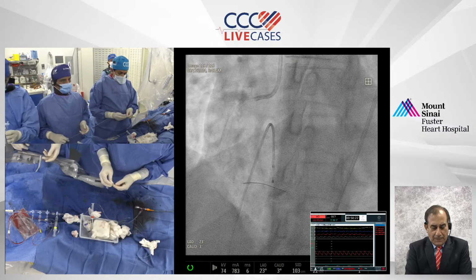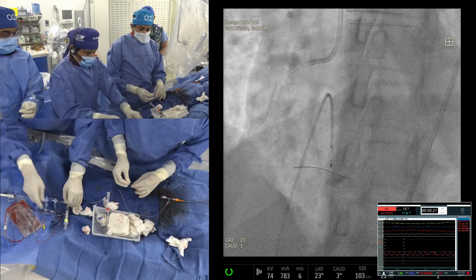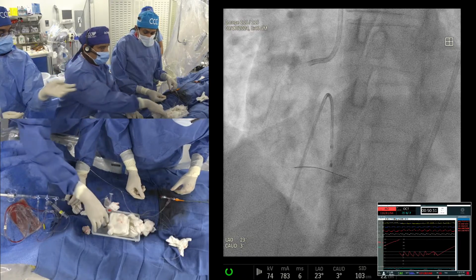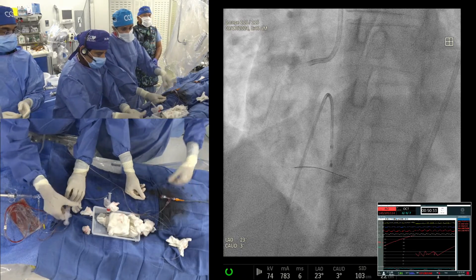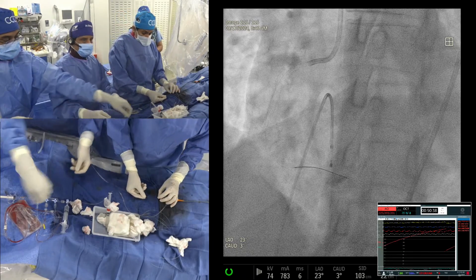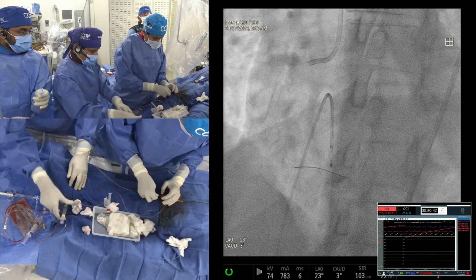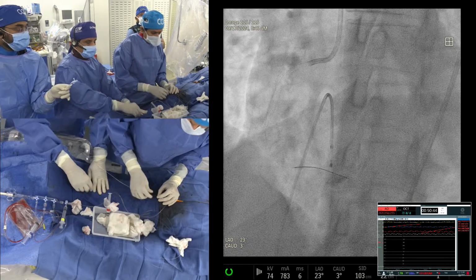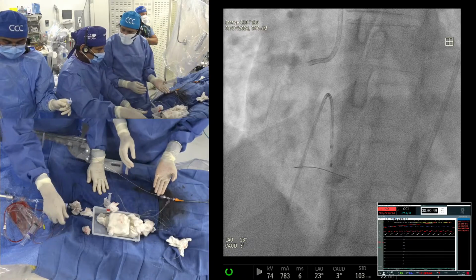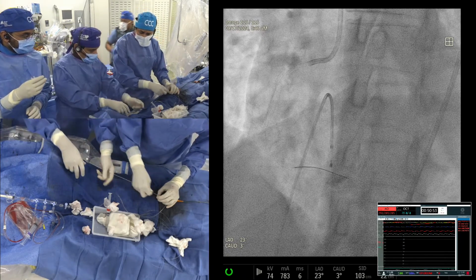The question also is why we still have ST elevation. We have a distal diffuse disease many times. All this debris that we have created has no outflow, though the flow is very good. That could also be a reason we have this persistent STs. I thought slightly it may be related to the guide too. I'm not convinced. A couple of times I was noticing when the guide. Everything is coming out here. That's okay. Atropine. Give some more verapamil.